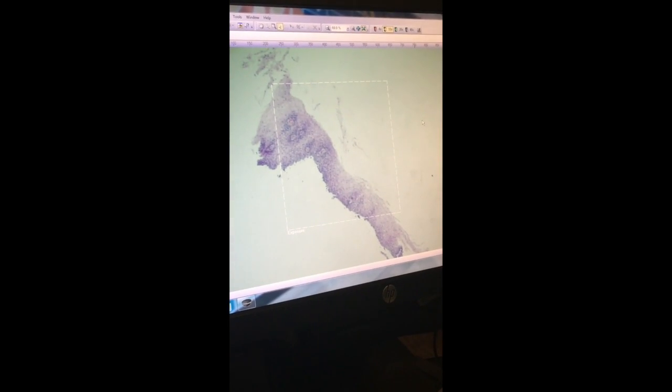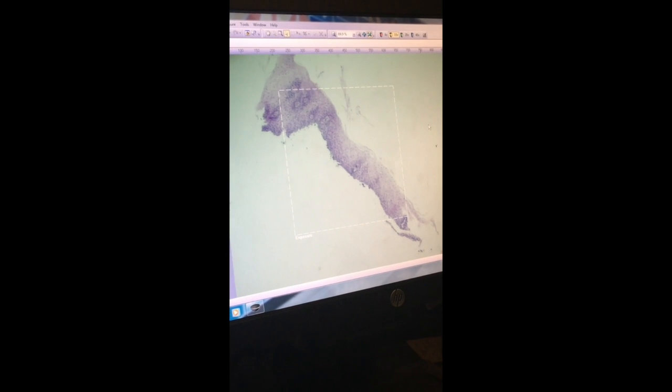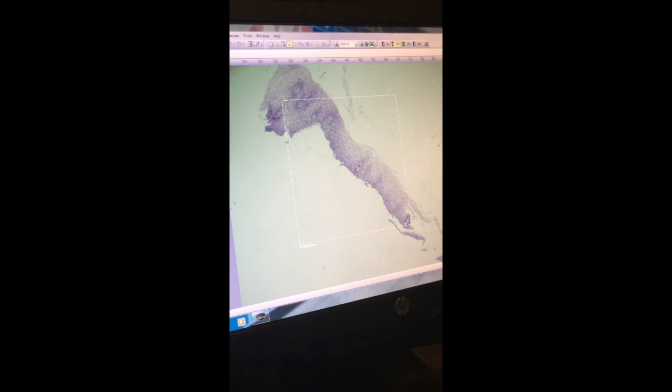And this is someone that has like a lower count of eosinophils, so just over active is what we would call this person. They have like right around 15 to 20. Just over that active mark, right? And so you can already kind of see a little bit of a difference, right? So it's kind of a bigger layer, it's a lot darker of a purple.